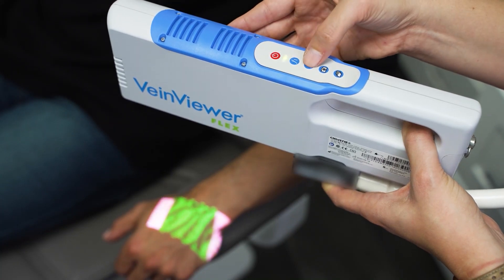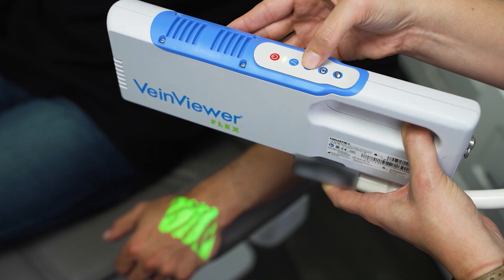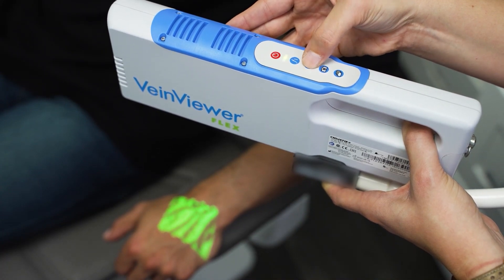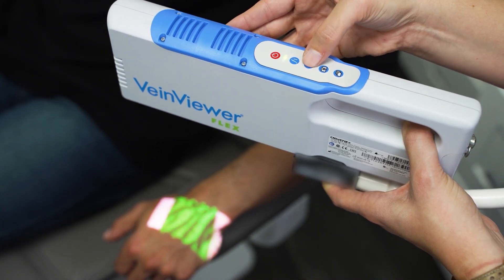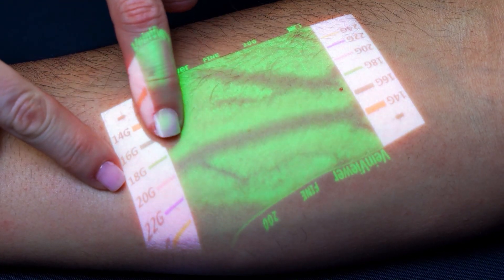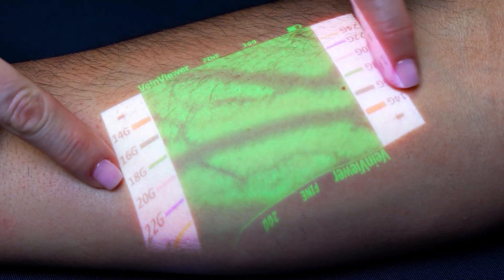To make the reference graphic disappear, press and hold the F2 button. Press and hold again to make the graphic reappear.